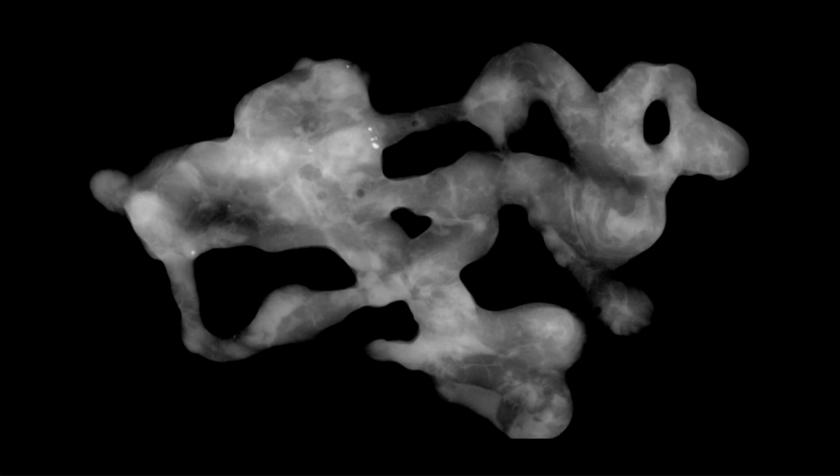You have to use your macular vision, your central vision, to see fine detail. And if you're not concentrating, you can go right by it because you only have a few seconds to look at every little bit of the whole real estate of the breast.